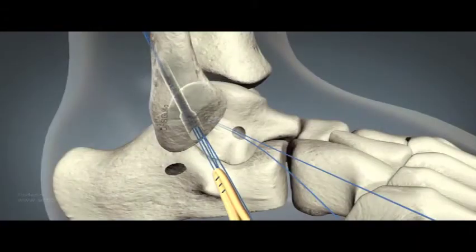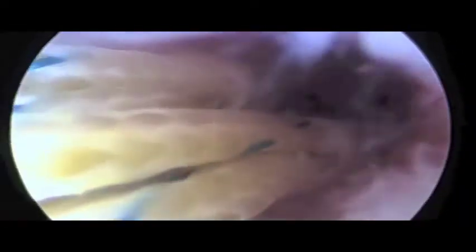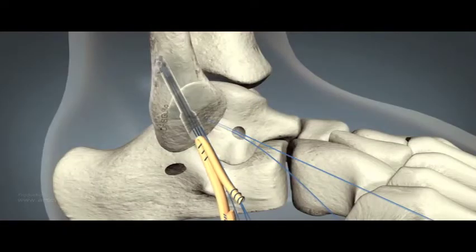Next, a gracilis graft is prepared and passed through a zip loop. This is then inserted into the fibula tunnel and the button secured against the posterior cortex. The graft is drawn up into the tunnel by tightening the zip loop and the graft secured.